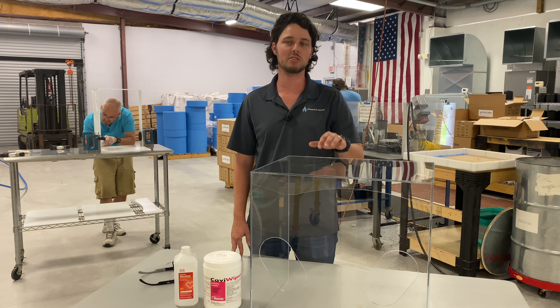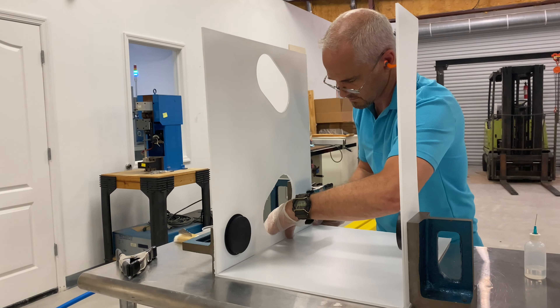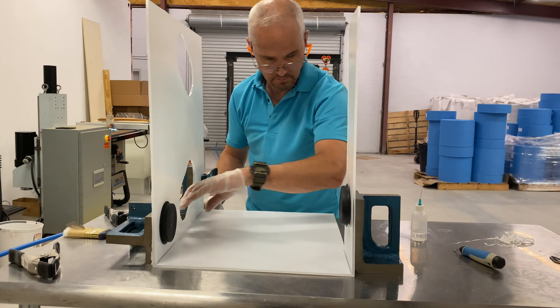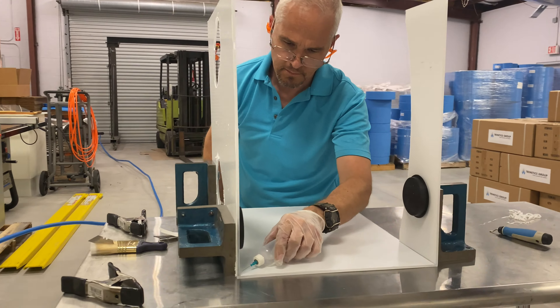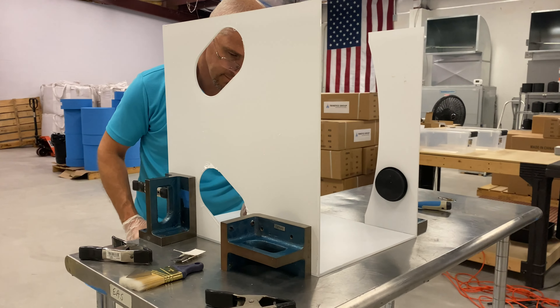We have also begun manufacturing intubation boxes. An intubation box is a simple device that protects healthcare workers during the intubation process. Patients with critical cases of the coronavirus develop acute respiratory distress syndrome and need to be put on a ventilator.